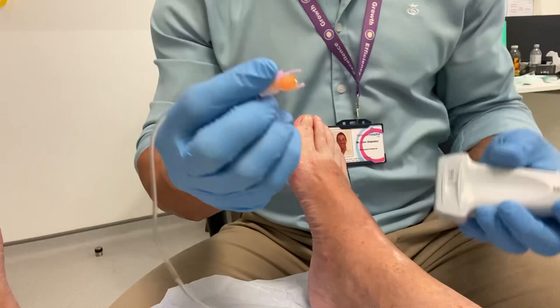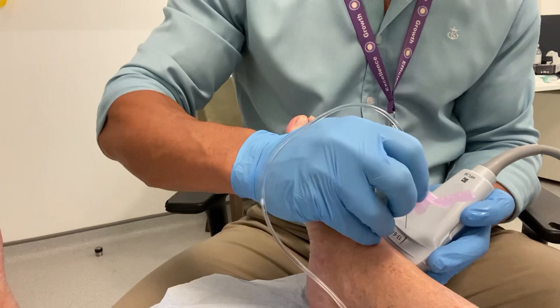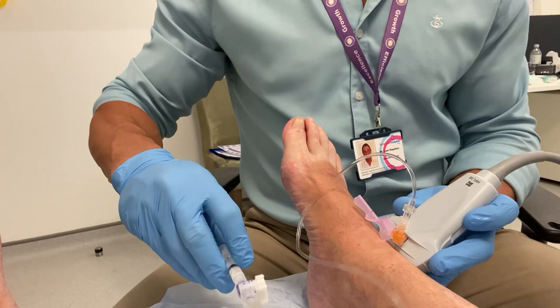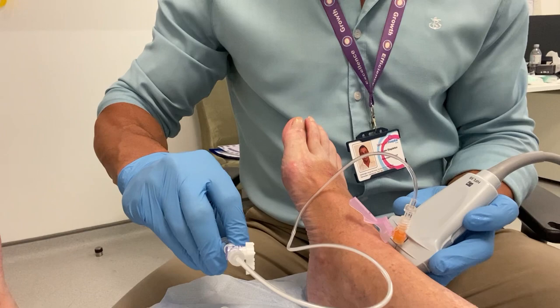I'm doing the ankle injection first. We're visualizing a nice clear access point to the ankle, taking an anterior lateral approach. Her osteoarthritis was certainly more pronounced to the medial aspect, and the joint line was more closed on that side.